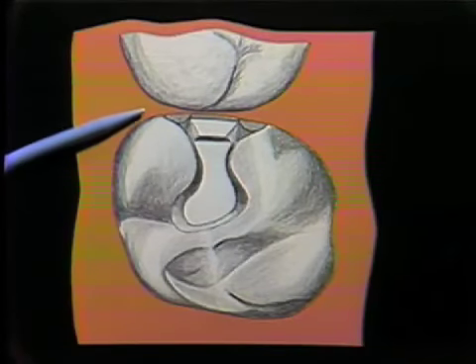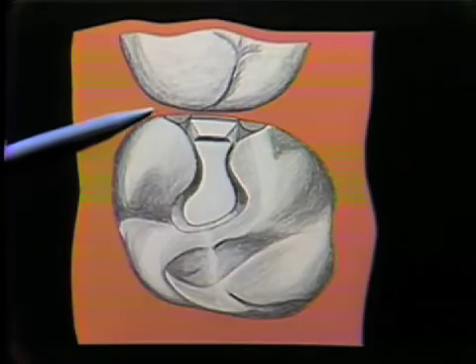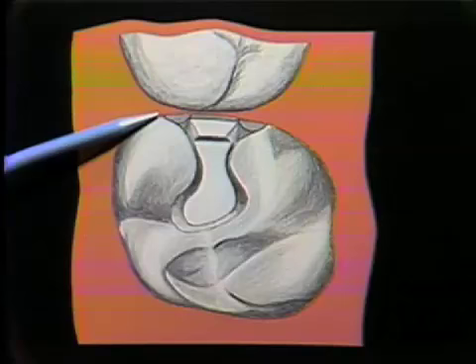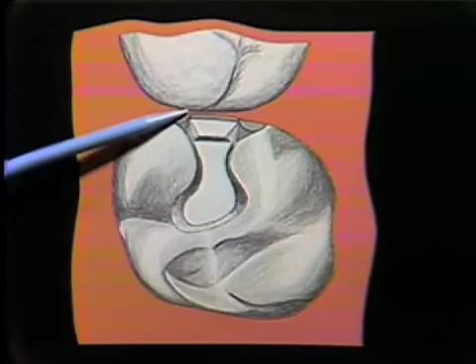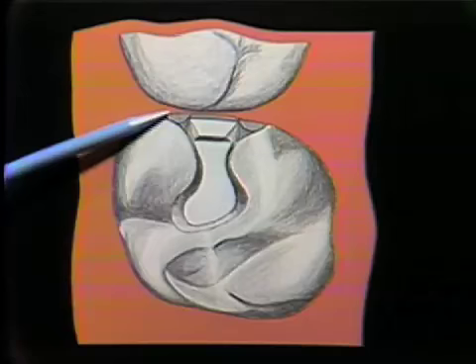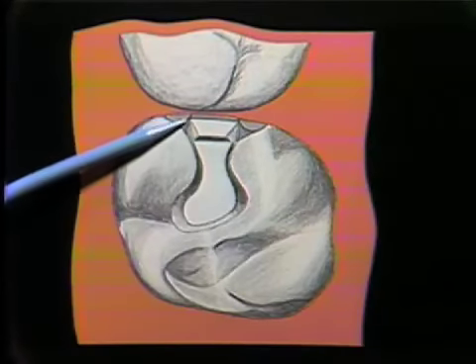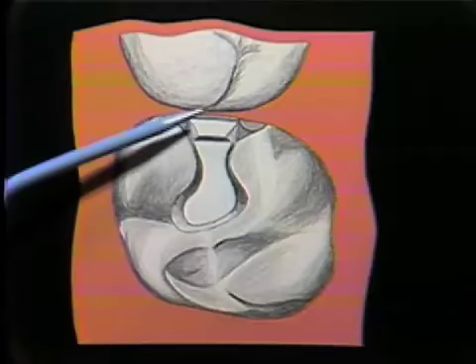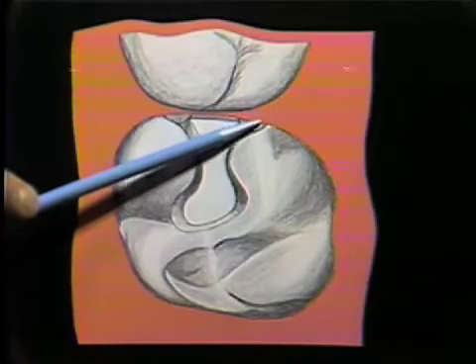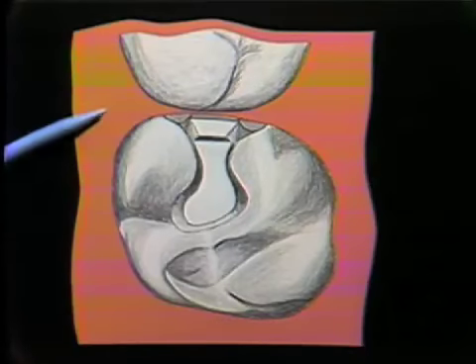The modified slice looks just about the same as does a full tapered slice from the diagram and looking from the occlusal. However, if you will remember that this possibly is slightly less sliced than we had on the full tapered slice at the occlusal. In the modified slice, again, note the box. It is not brought into immunity on either the buccal or the lingual, but we are bringing it into immunity with the disking of the tooth, again, removing only enamel.